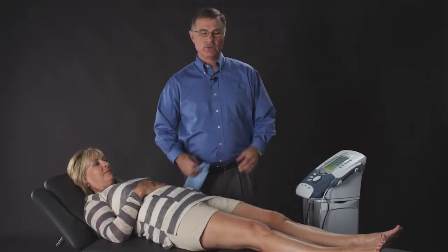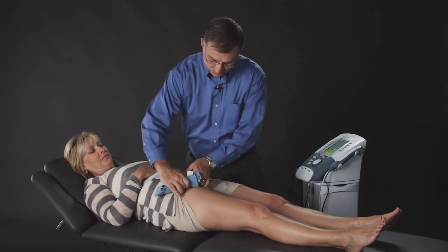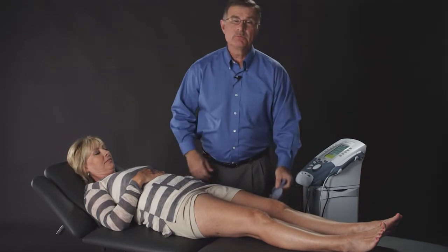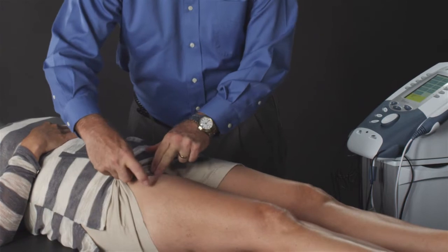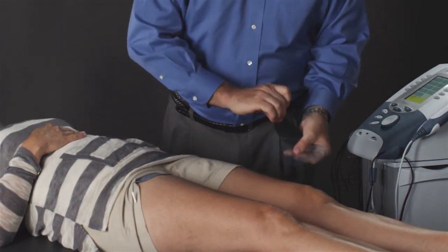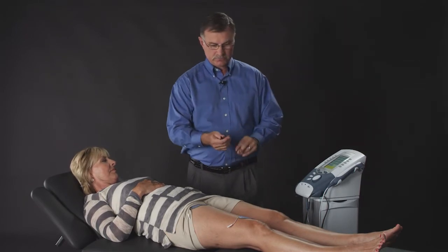Let's get started. The first thing we'll need to do is prep the patient's skin. We'll use a warm washcloth to remove any excess oil from the skin. Since the quadriceps is a large muscle, we'll want to use a larger electrode, and we're going to use the DuraStick 2x4 electrode. We will place one more proximally on the quadriceps muscle and one more distal to medial. We'll then plug the lead wires up to the electrodes.